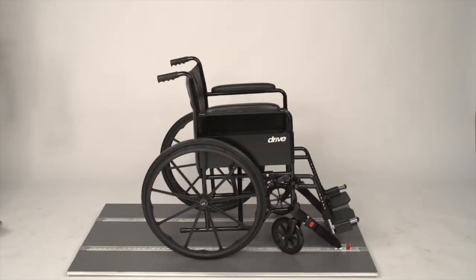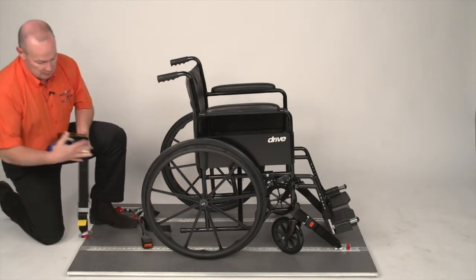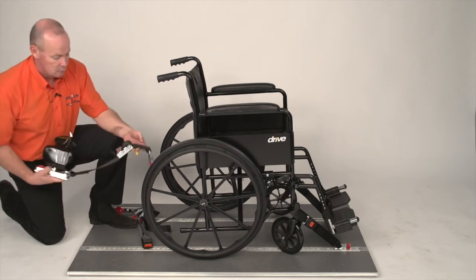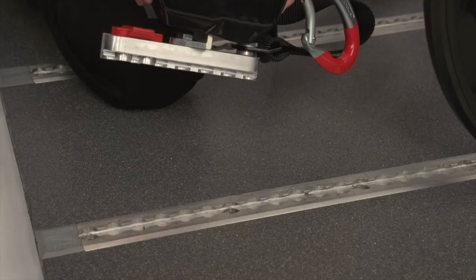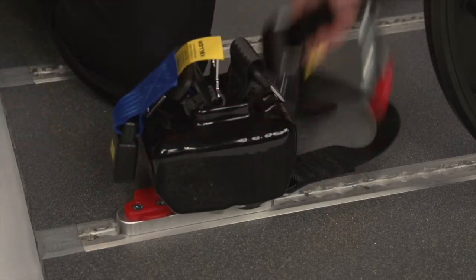We're now going to secure the rear of the wheelchair. We have a combined system, so the passenger harness and the wheelchair restraint are all combined off of one unit. We take hold, put the clip into the track, again making sure you hear it click.